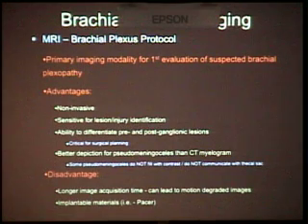Now, MR, on the other hand, is really the go-to imaging modality, in my opinion. You can see edema, you've got great soft tissue contrast. It's non-invasive. It's really sensitive. You can help differentiate pre- and post-ganglionic injury, so you can tell your surgeon, which can put them in different categories as far as, is it going to be physical therapy as the treatment and pain medication, or is it going to be a surgical case? And then you can get good depiction of pseudomeningoceles, as you can see them on myelography, but you get a little bit better visualization of them because some pseudomeningoceles will not fill with contrast.